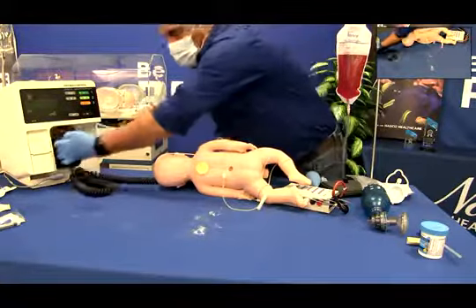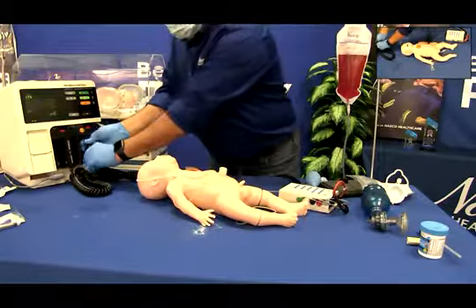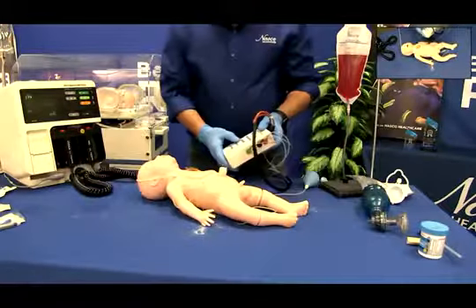After shocking C.H.A.R.L.I.E, the blinking rhythm will turn solid on the Interactive ECG Simulator and will be the rhythm displayed on your defibrillator or monitor.